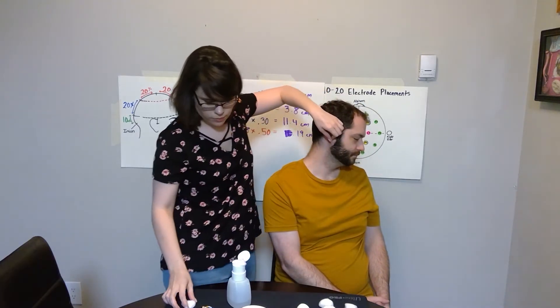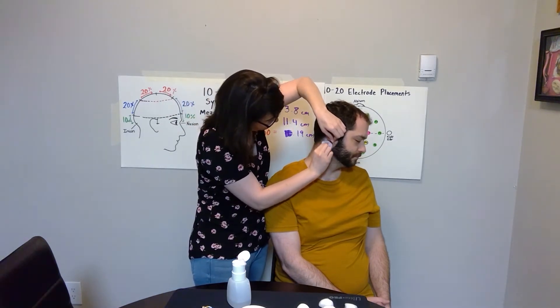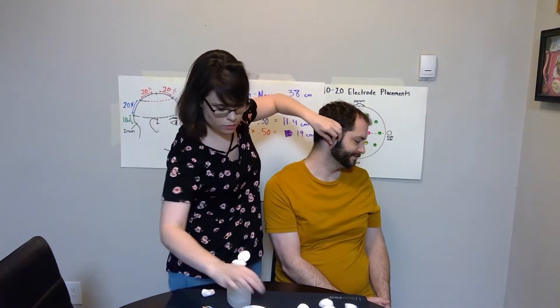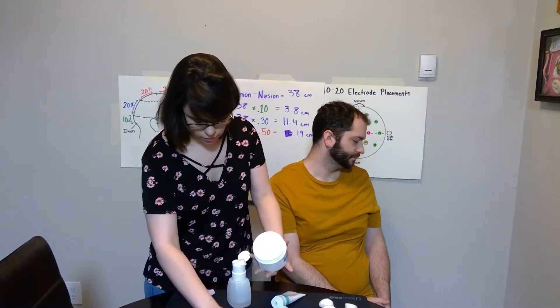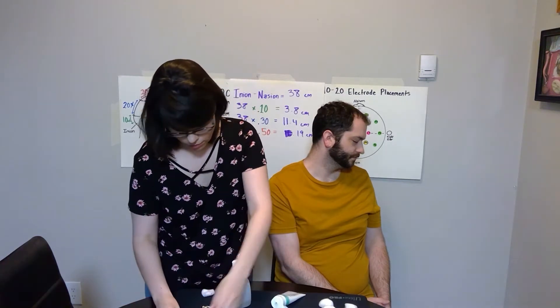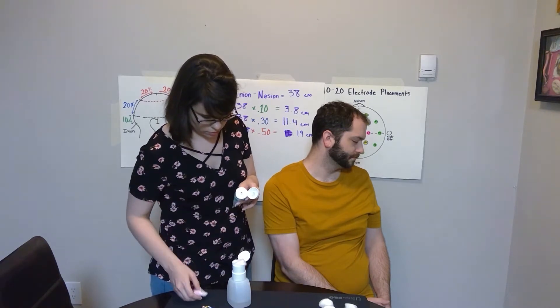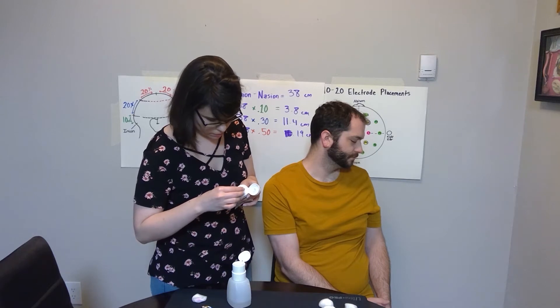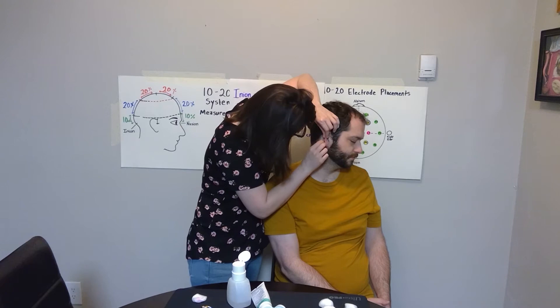We're going to start by cleaning the area with our cotton ball and alcohol. Then we're going to take our NuPrep gel and use it to exfoliate the surface that we just cleaned with the alcohol. You can use a cotton pad or your clean hands to rub the area behind the ear.